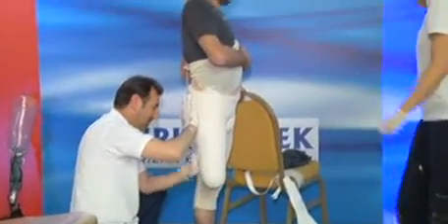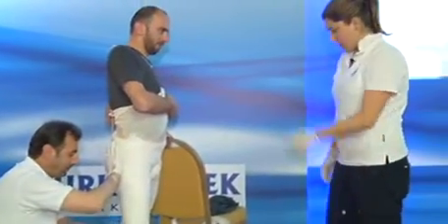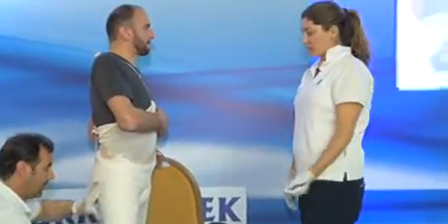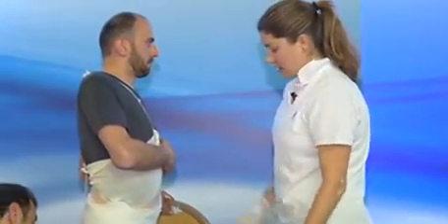Good. So just as that dries off, what I like to do is put some alignment lines on, as well as the line of progression for later on in my cast.